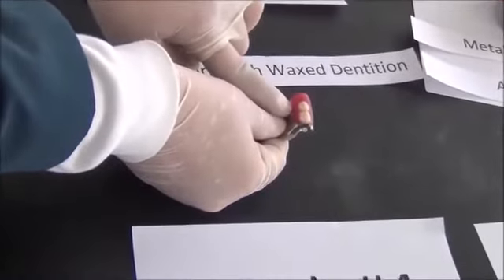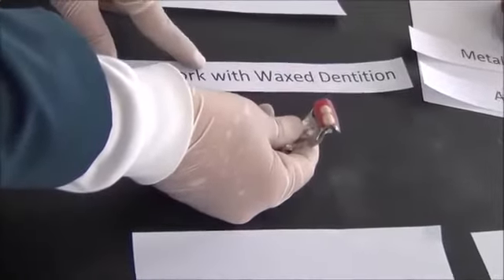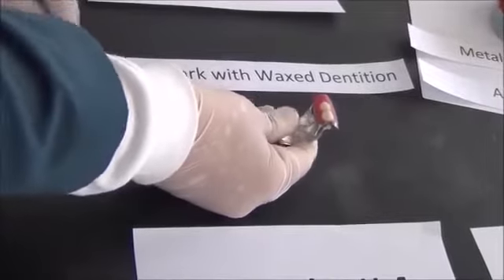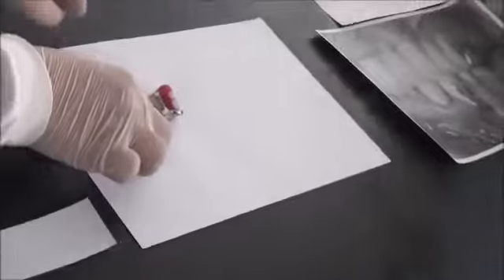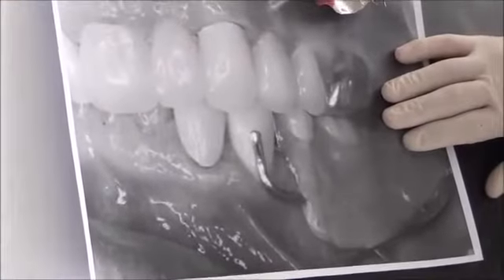It has the wax teeth and the acrylic. These are the acrylic teeth that will be in your denture later on. These are ready now to be sent back to the clinic. And the doctor has the partial denture there. He places it inside the patient's mouth. He tries it in.